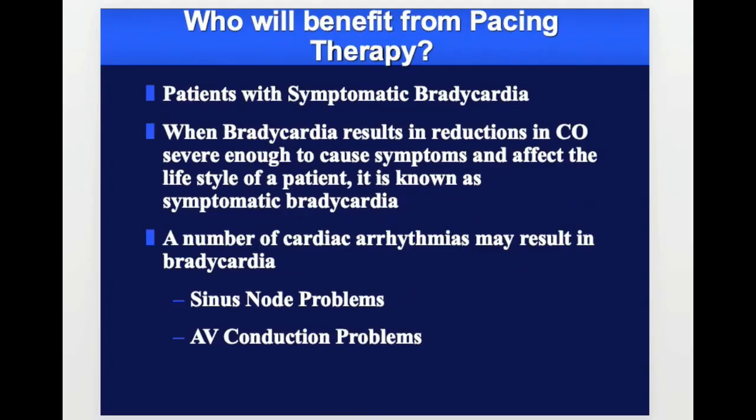Patients with symptomatic bradycardia also benefit from the pacing therapy. When bradycardia results in reduction in cardiac output severe enough to cause symptoms and affect the lifestyle of the patient, it is known as symptomatic bradycardia. A number of cardiac arrhythmias may result in bradycardia, like sinus node dysfunction and AV conduction problems.